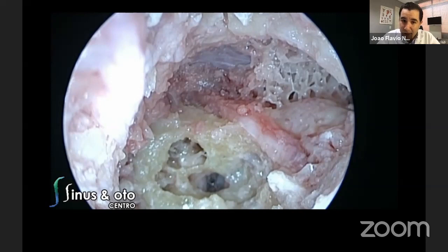And since we have the endoscopic anatomy nowadays, and the microscopic anatomy and its approach, we can have those combined approaches using the microscope and using the endoscope for both middle ear inflammatory conditions that extend into the mastoid, cholesteatoma as an example, or also other kinds of lesions, including lesions in the middle fossa, including lesions in the facial nerve, or including lesions in the vestibule or in other areas that you can perform.